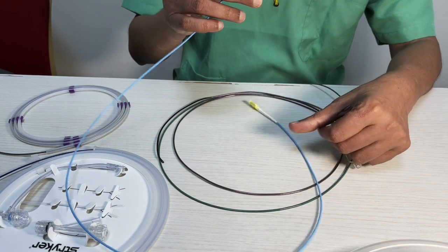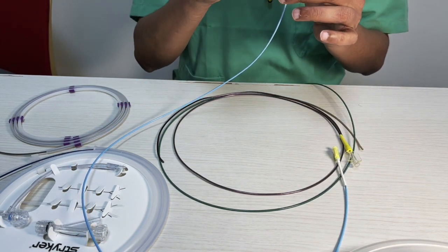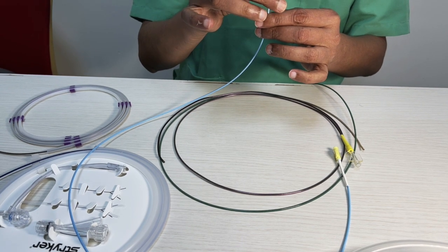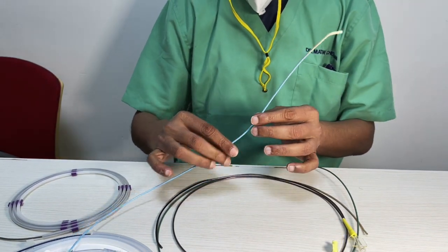So one of the things we see, they don't have multiple zones. If at all you want to talk about a zone, this has got just two zones. One part which is somewhat soft, you can see this, and a stiff part here, right?